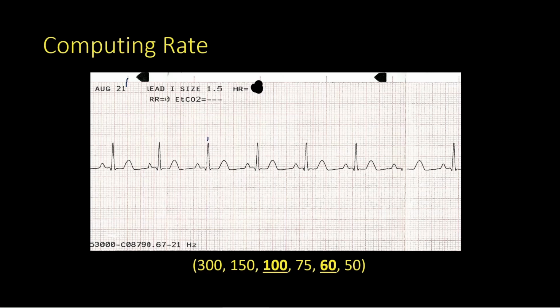So if I say this is the first line and I start a countdown: 300, 150, 100, 75. Now I say it's just faster than 75, so I'd still say it's about 80 beats a minute. One thing you'll notice about the countdown method, because you have a 100 and a 60 in your countdown cycle, you can always determine: is it over 100, is it between 100 and 60, or is it less than 60? So if we were going to look at this strip, we'd say it's probably about 80 beats a minute.